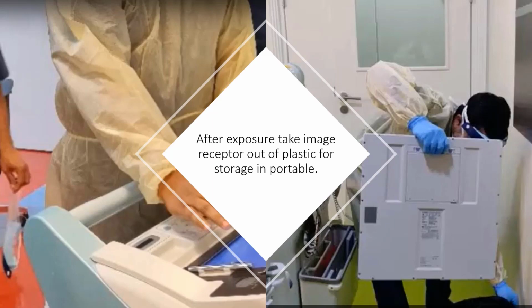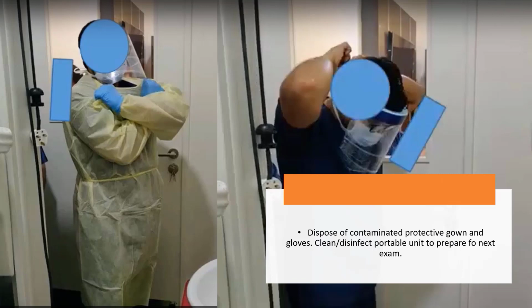In addition, we have to look at how we change when we go into the room to make sure that we have the disposable gown, gloves, and mask, and how we change and dispose of those after the exam. Remember, after the exam, many of the gowns and gloves and masks we wear are possibly contaminated, and they need to be disposed of correctly. So there is a process for you to understand how to dispose of the disposable gowns and gloves and where to. After disposing of the disposable gowns and gloves, we must also then wash our hands and get ready for the next exam.